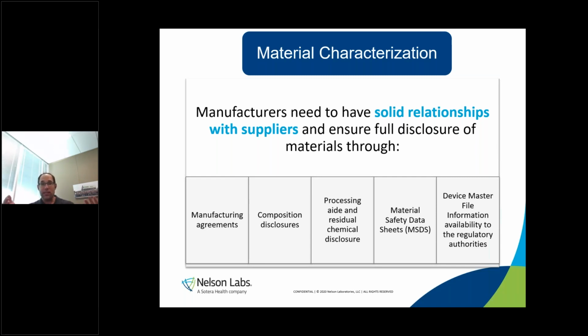And that allows you to now say, look, the FDA is aware of this, but more importantly, what testing was done. Now, that's important. You want to find out what testing is done. Just because they have a master file doesn't mean it's automatically going to help you, right? The master file will have either maybe just a cytotox test or maybe just even a discussion about the materials, all the way to complete testing on a sterilized device. So it's still ambiguous on how well it would help you. But if they have it, definitely try to get that information from the supplier.